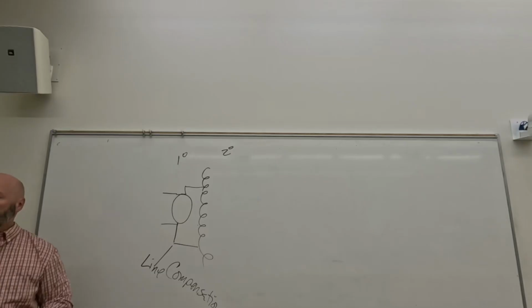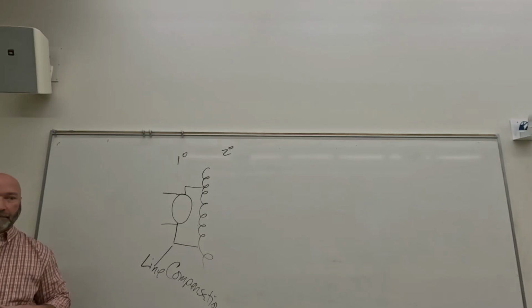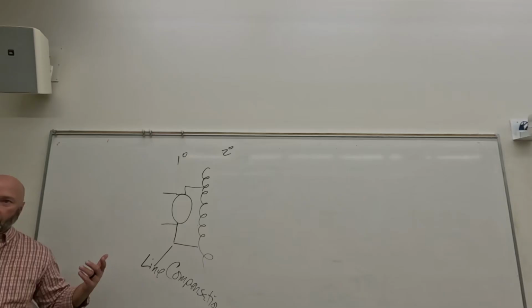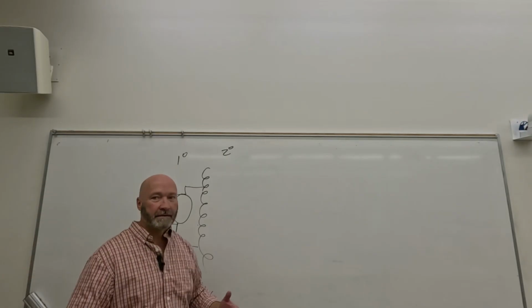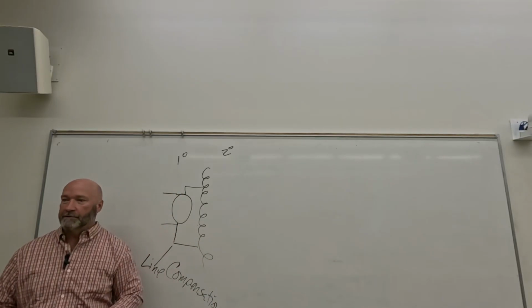We also control focal spot. As Amy talked about, focal spot and its relationship to sharpness or recorded detail. We control focal spot there. The smaller the focal spot, the more sharpness. But what you're really controlling there is the size of the filament that you're going to use. So what do we put on and around the filament? We have a number of different words for it, or terms, or phrases, I guess. Create a space charge, which is thermionic emission, right?